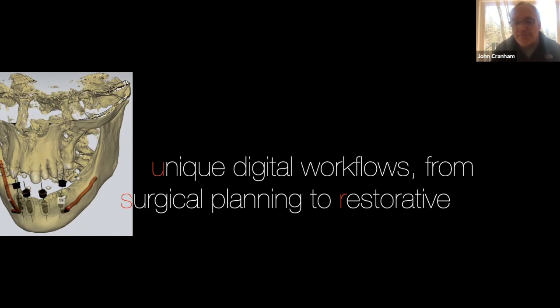So it felt great. And here's the thing. Once it goes in the mouth, it was kind of canted and the teeth weren't in a good place. But if you have a good bite and good intaglio, and you have photographs, think about it: if you're doing a big crown and bridge case and there's a cant, we see all that and correct it in the wax up. So that was cool. They use that as the initial data. Then we set the teeth up.